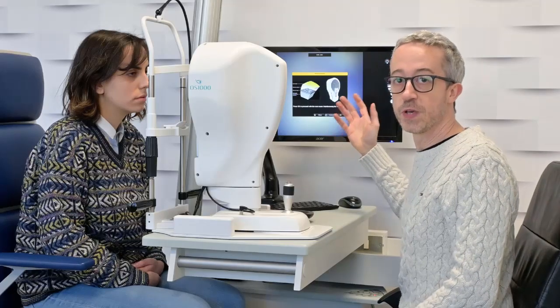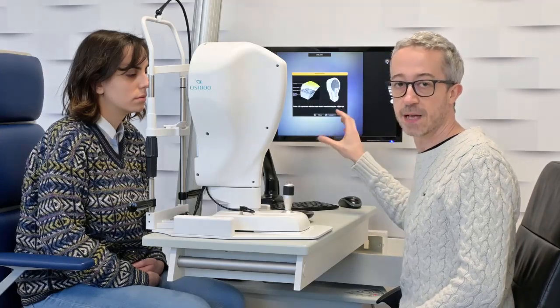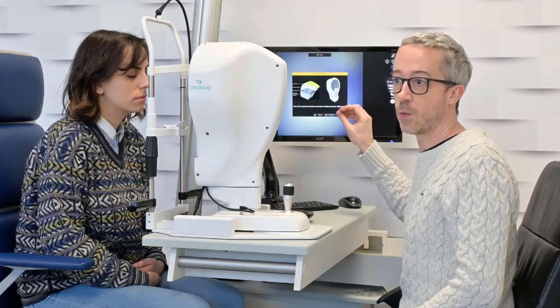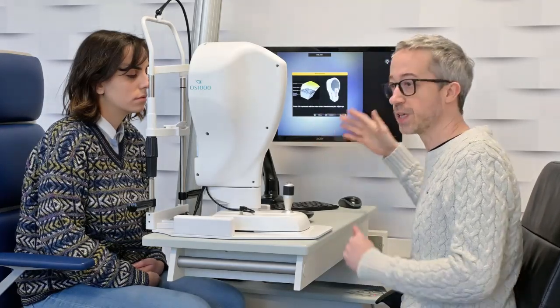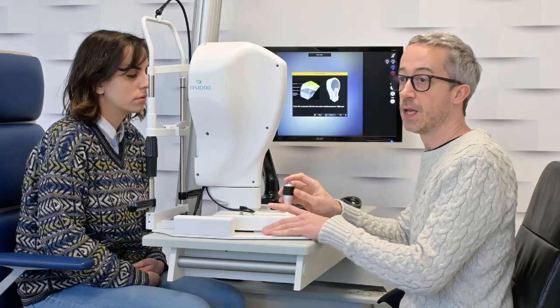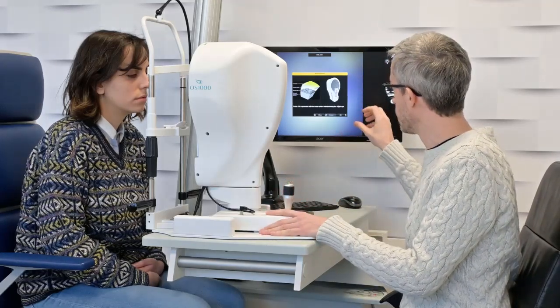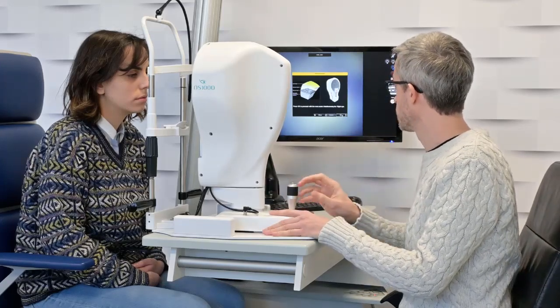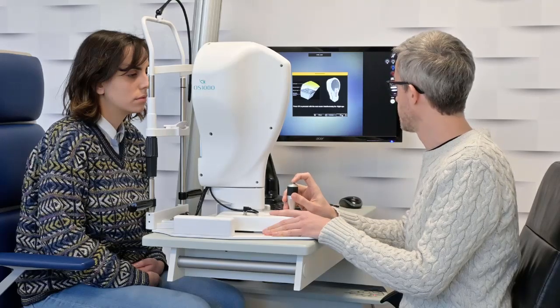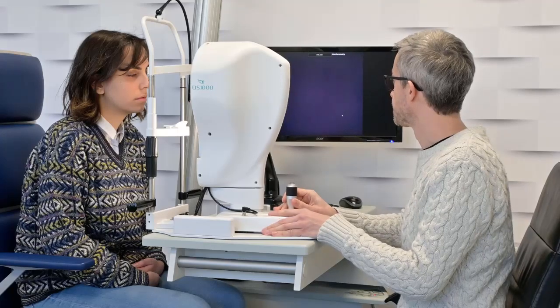As you can see, the wizard procedure is suggesting which exam is the next one, so which exam and which eye we have to take during every acquisition. Then to skip this window, you can press OK with the mouse, or you can press the button on the joystick of the instrument.